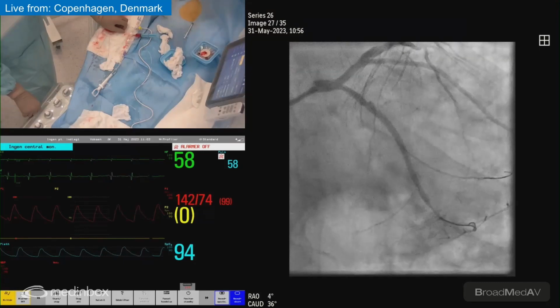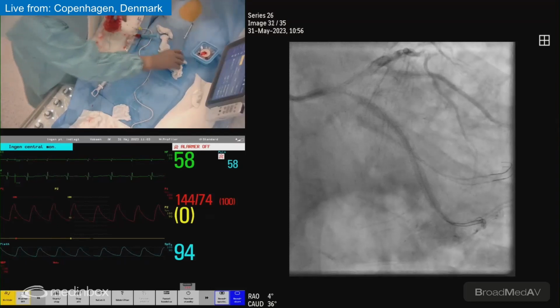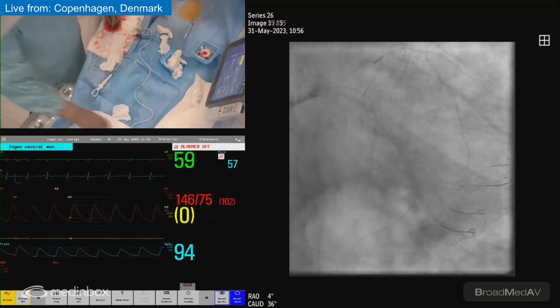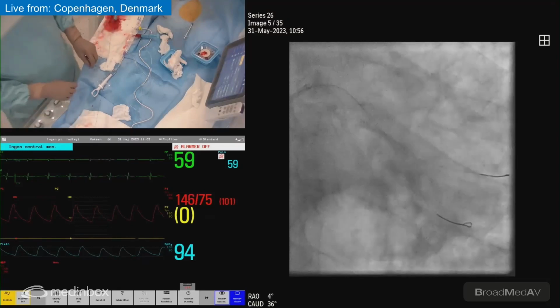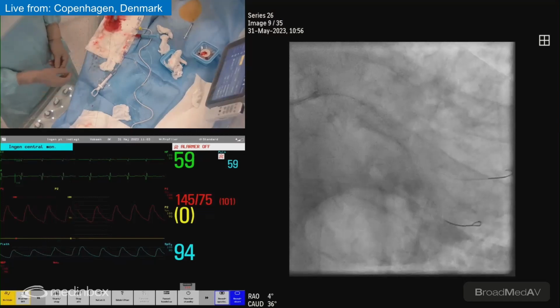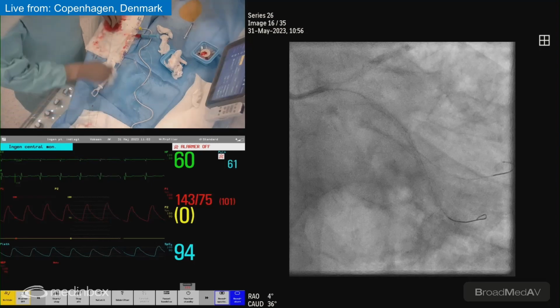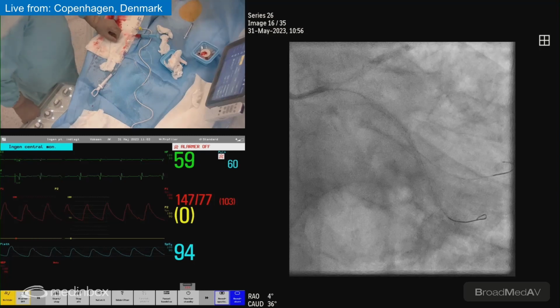That the stent is a little over-dilated, but yeah, we will have some remodeling of the distal part. So now we do some POT proximal to the marginal, and then we will have a further stent, which should be a diameter of 4.0. We only have 3.5 and 4.0 in our institution. We don't have 3.75. So that's why we consider either a 3.5 or a 4.0. But we go with the POT now with a 3.5 by 15 non-compliant balloon.